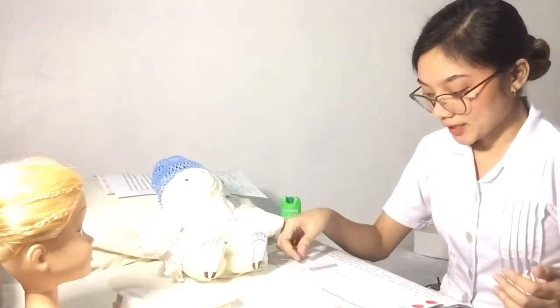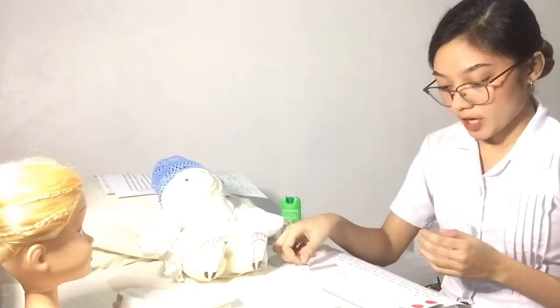So, good morning po. Now I am going to perform the newborn screening test to your baby, but before that, I have to ensure first that the expiration date of the newborn screening card has not passed, okay? Then, we have already done filling out the information here sa demographic data portion of the card, and I hope na tama naman po yung mga information na you said sa akin a while ago.